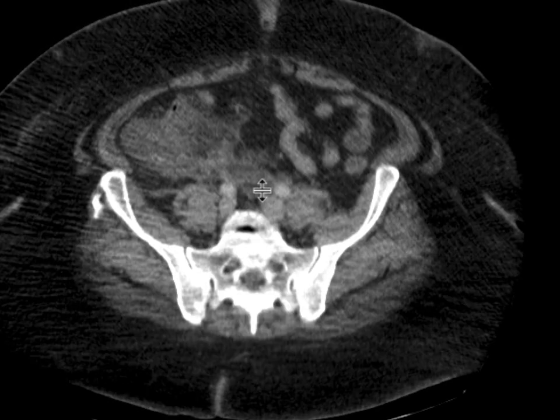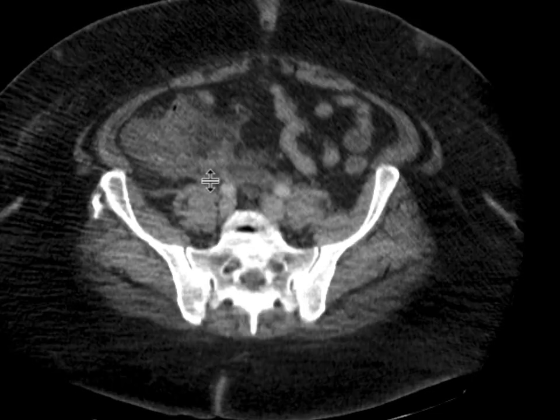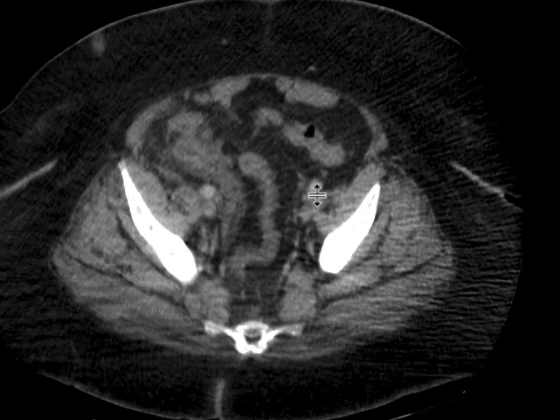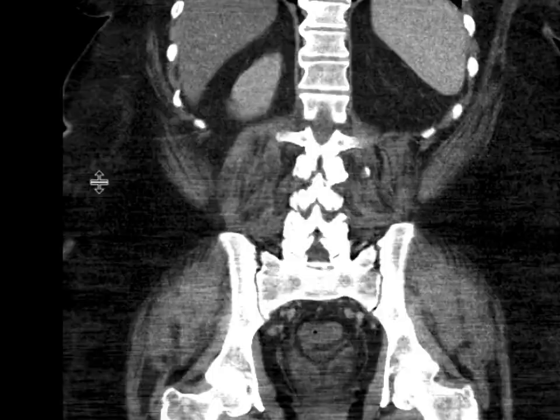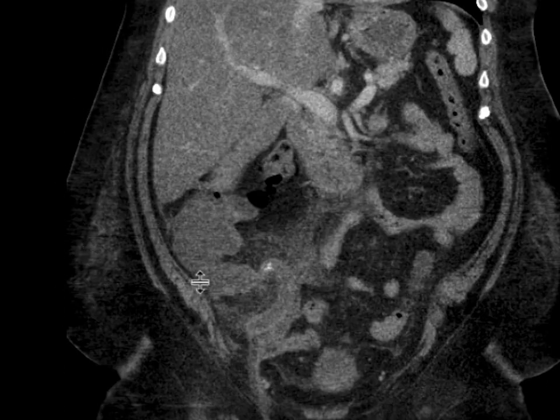If we're able to follow it, we can see that it goes to about this area here and then curls all the way downwards into the right lower quadrant here in the pelvis. There is lots of fat stranding and fluid surrounding this. Looking at this on the kernels, we can see it very nicely — this blind-ending tubular structure with inflammatory change around it.